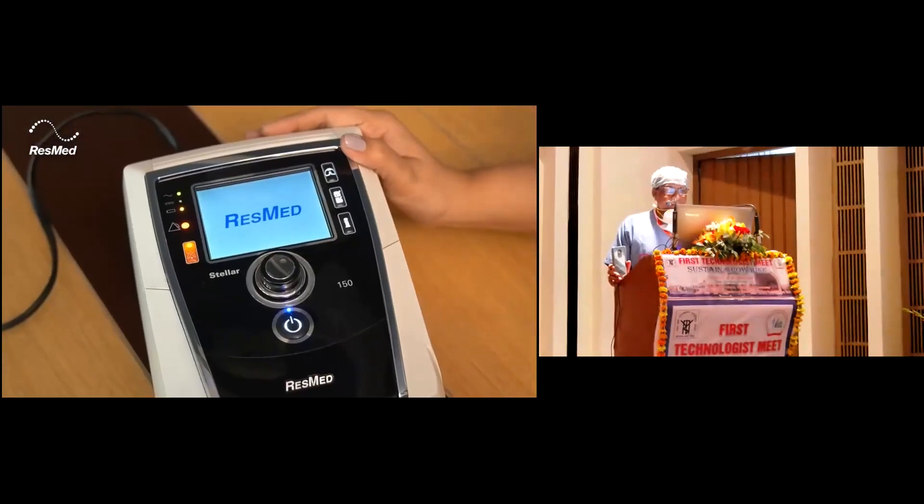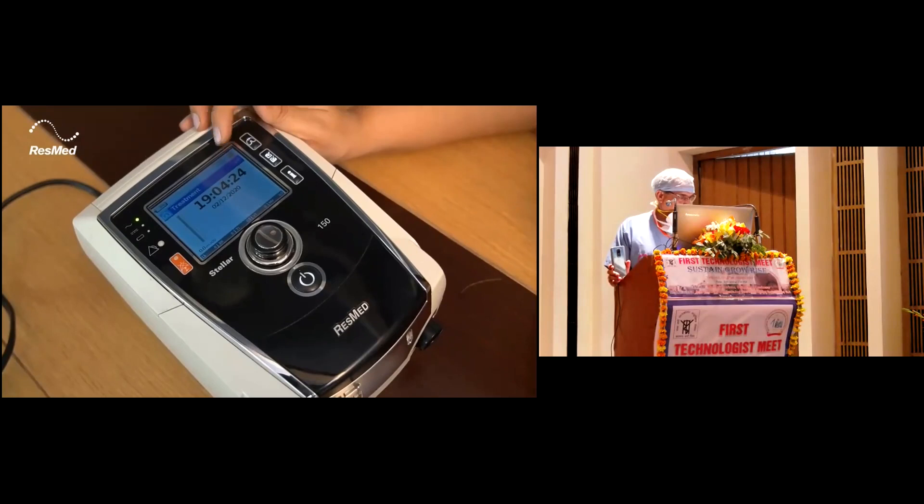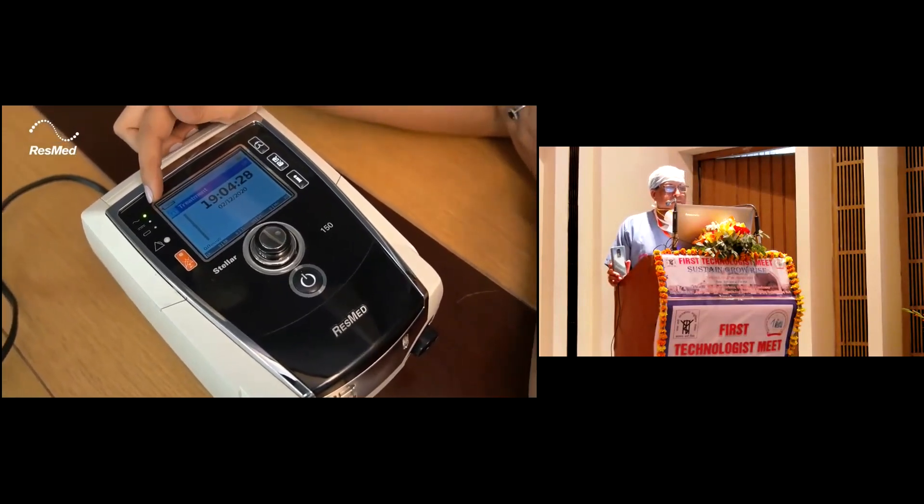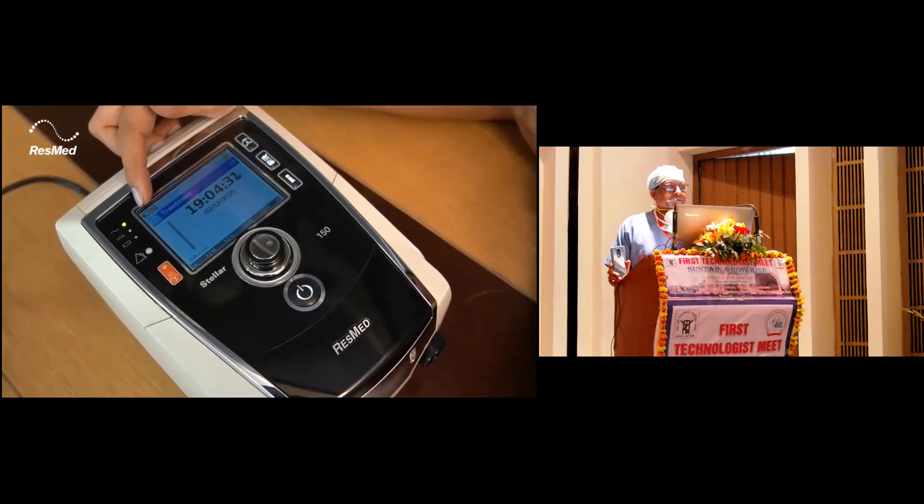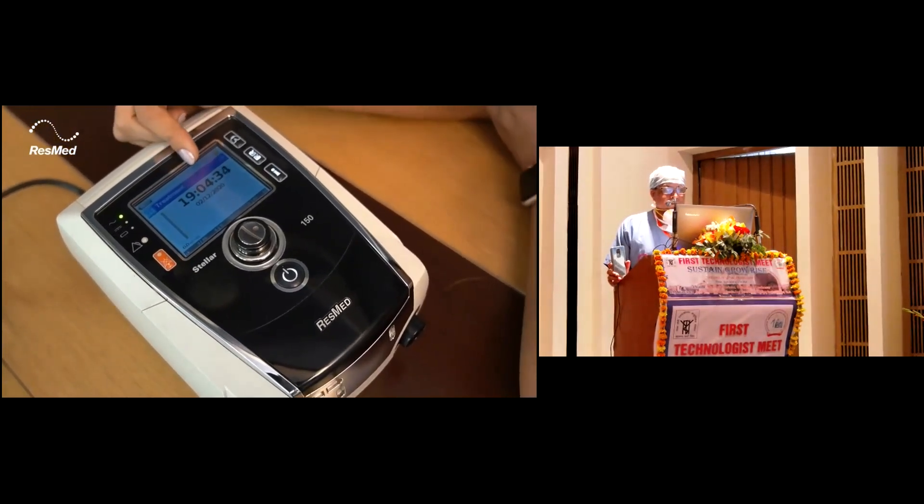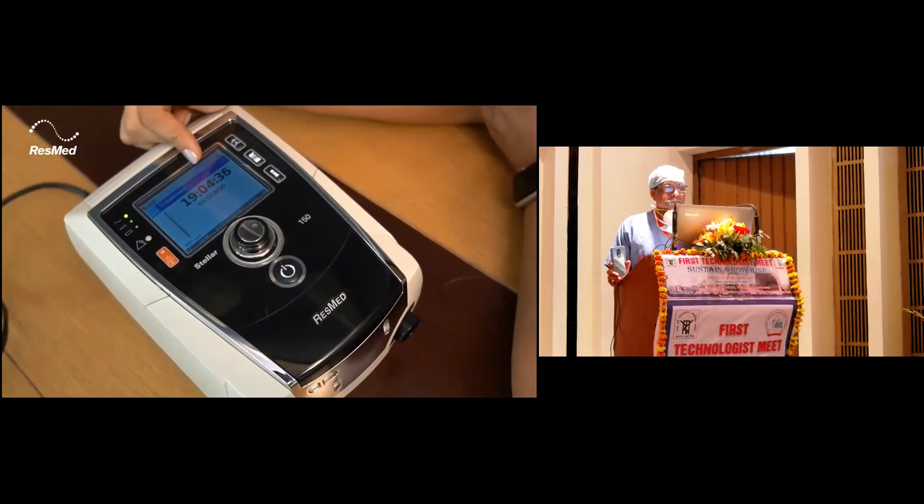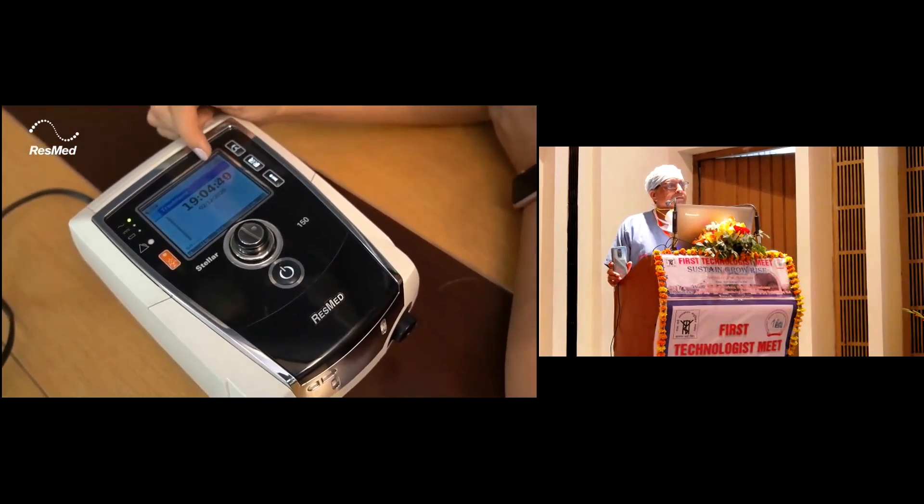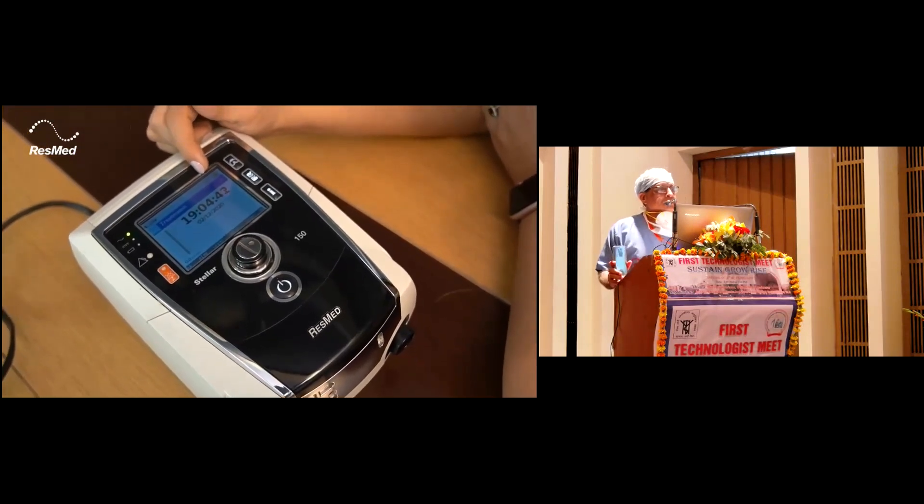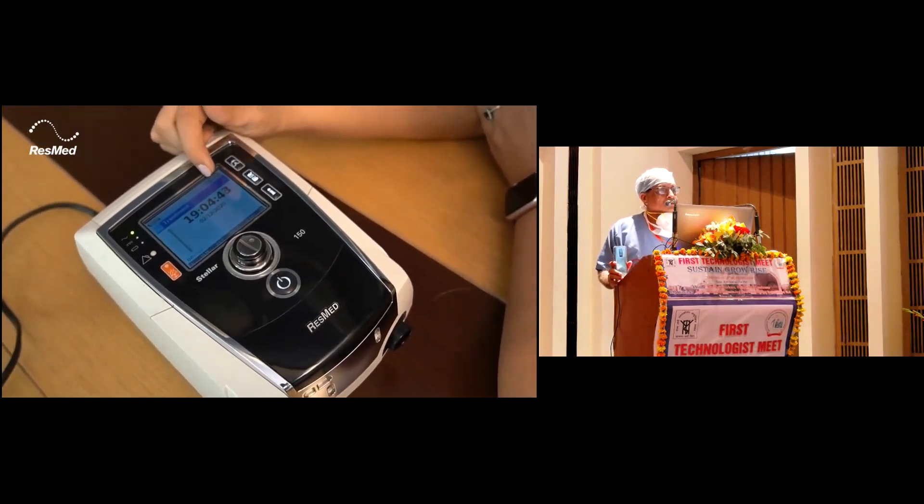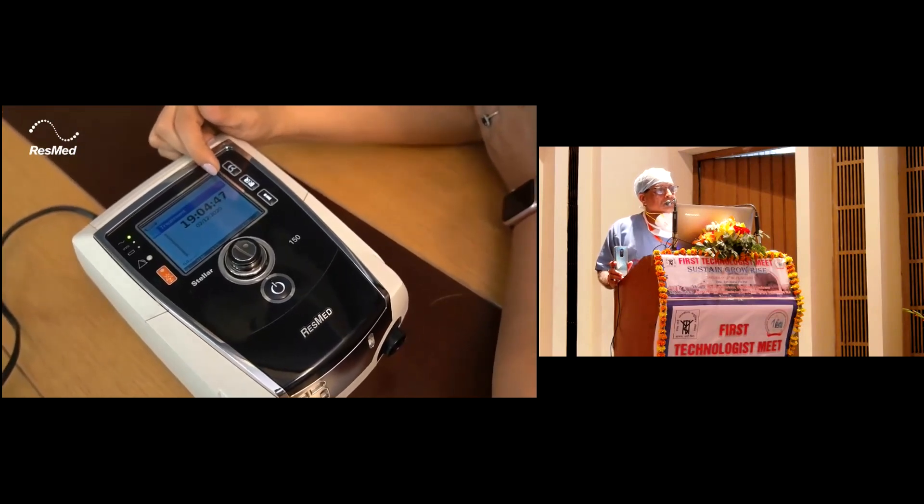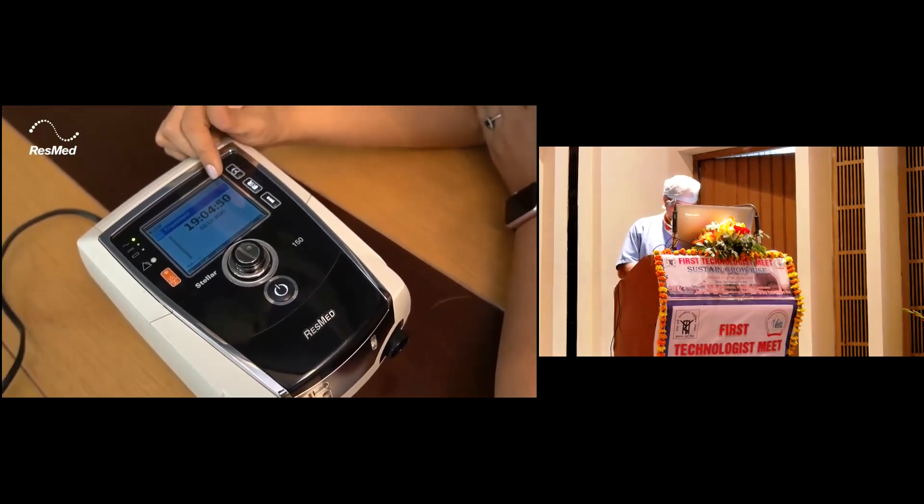Once we turn on the Stellar, the display lights up. In the display, the left upper corner shows the battery indicator. Post which you have information on the topmost bar, which will be seen once we start ventilating the patient. The patient right now is on program one on iVAPS mode, and here it is clinically locked.